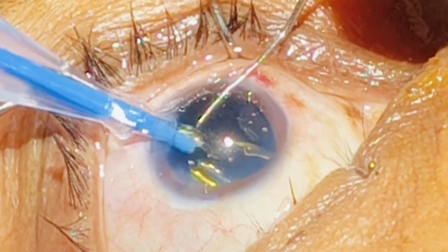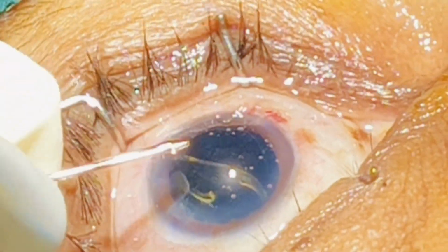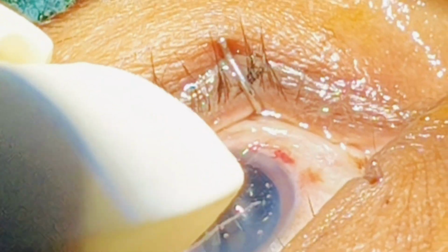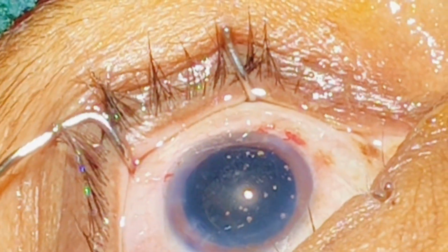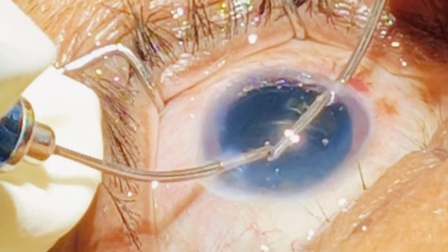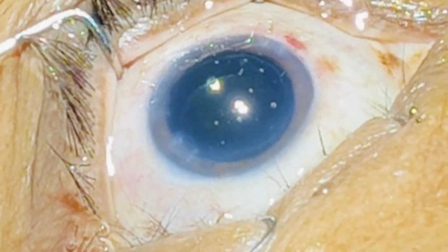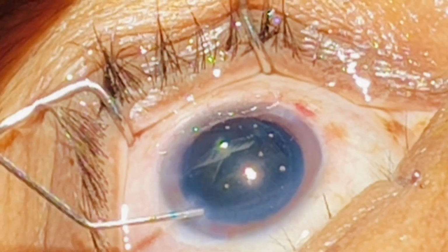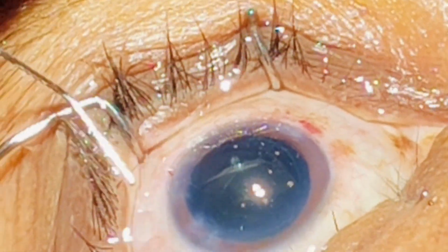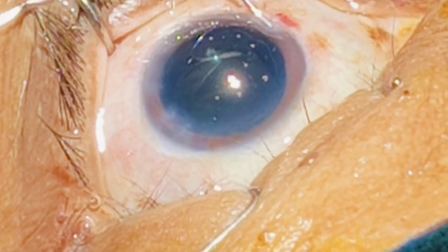See, you have to see how nicely the lens unfolds. Now we'll dial and put the trailing haptic also inside the posterior capsular bag. Yes. Just hydrate the side ports. As it's a topical case, the patient is slightly squeezing the eye now.